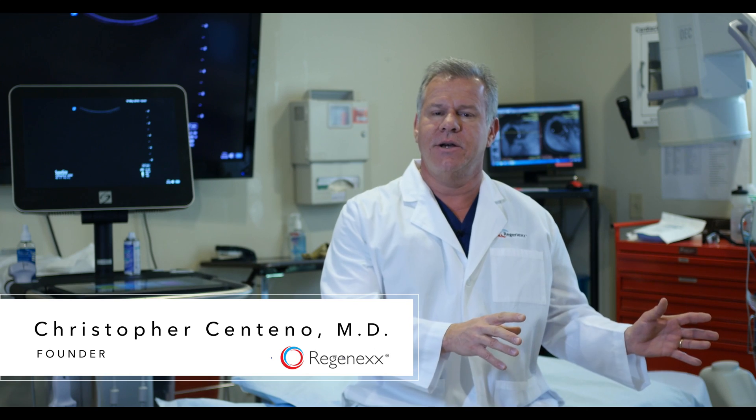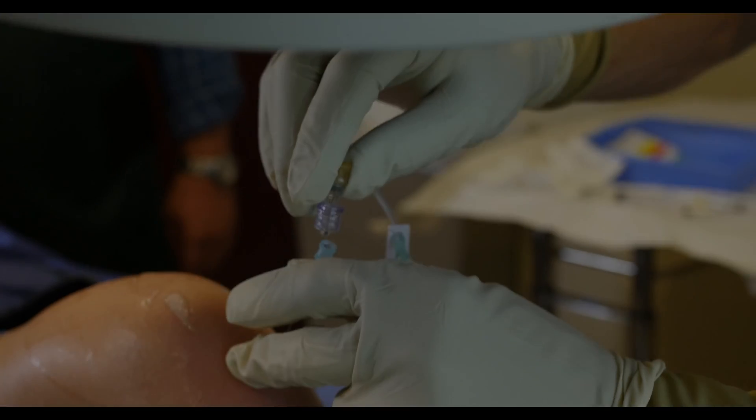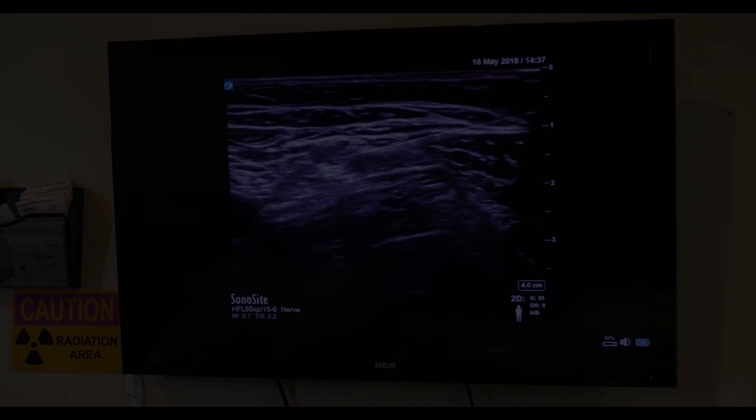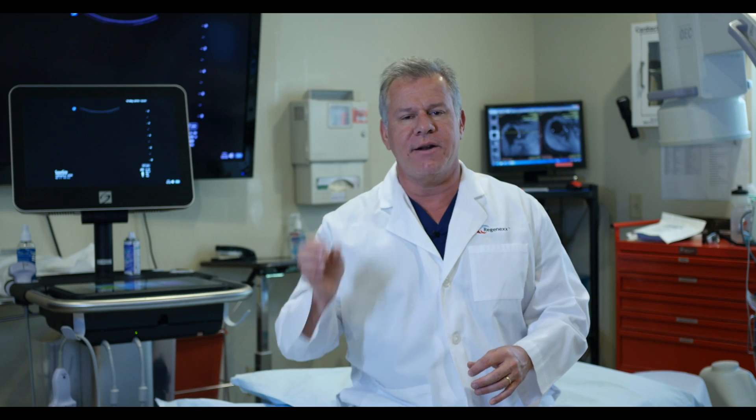To really understand why Regenexx is very different, let's take a look at one of our procedures. What you're about to see your orthopedic surgeon can't do, the guy down the street that does a little bit of ultrasound can't do — so let's take a look at this advanced, precise guided work.